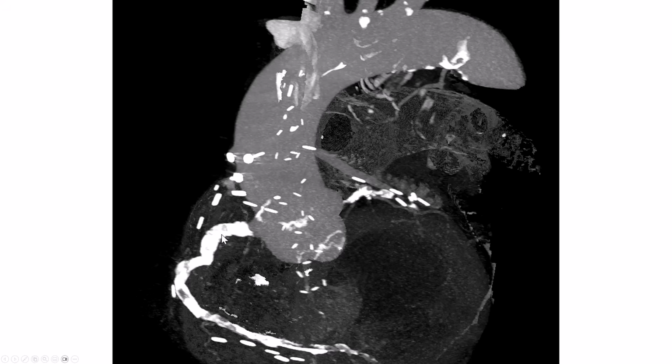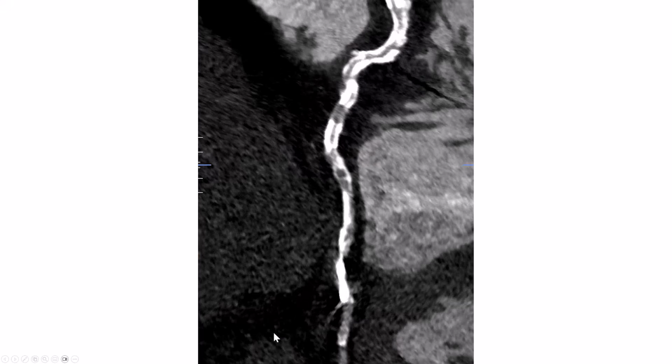This is the MIP from the coronary CT, and we see the previous stents. There is diffuse disease and significant calcification distally. And this is the MPR from the right coronary artery. Again, these are the stents. And there is calcification in the distal vessel.